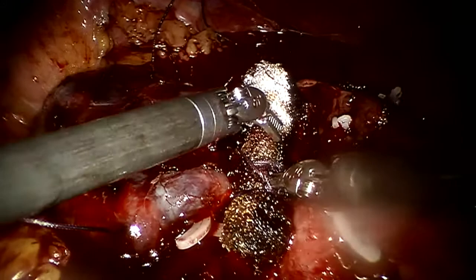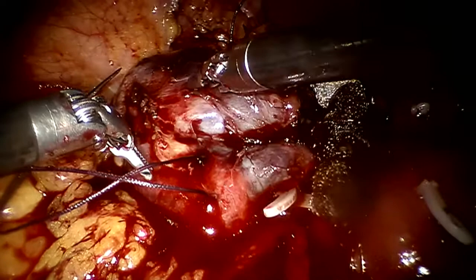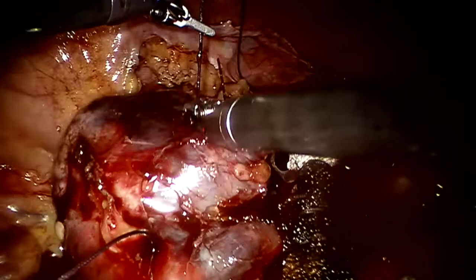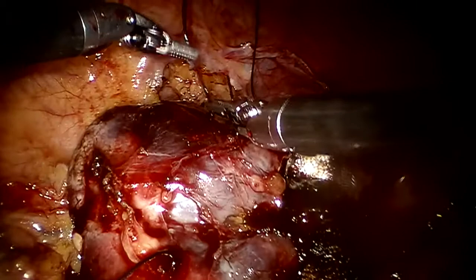So you can see now, look at this, guys. The line of demarcation has shrunk. Okay, there was some spasm here, but you can see, Vincent, all this is nice and pink. Even the lower pole. And you have to flip the kidney back again. Maybe this will help also to have a better perfusion. Yeah, very good point. Okay, here we go. Back me, please.